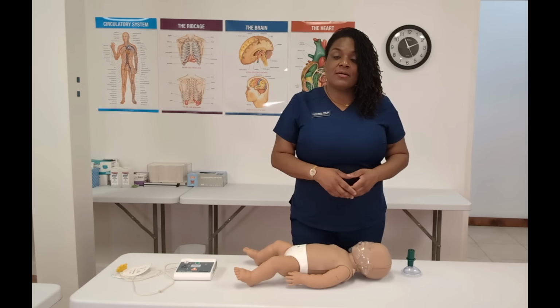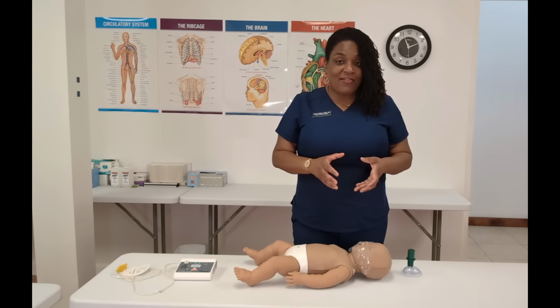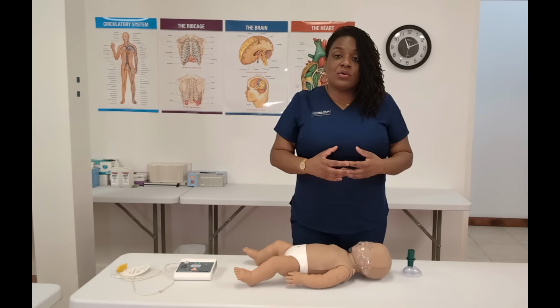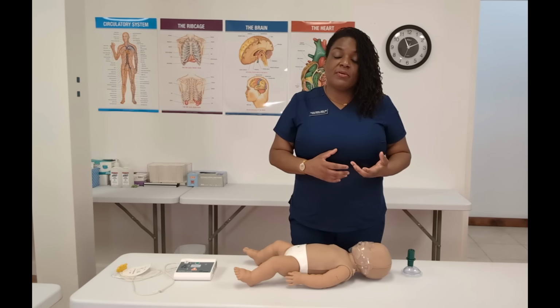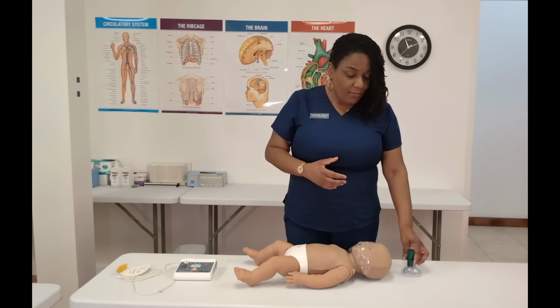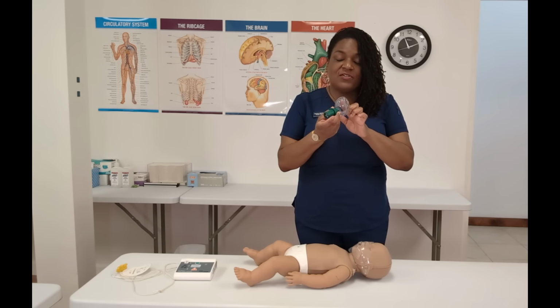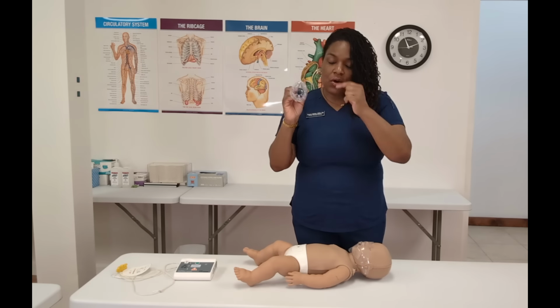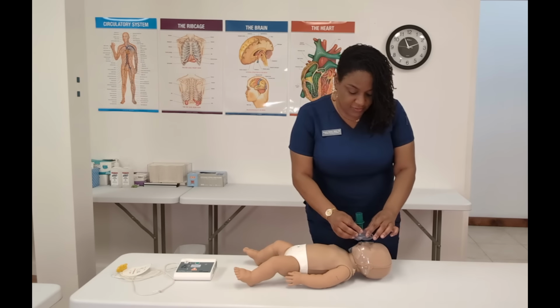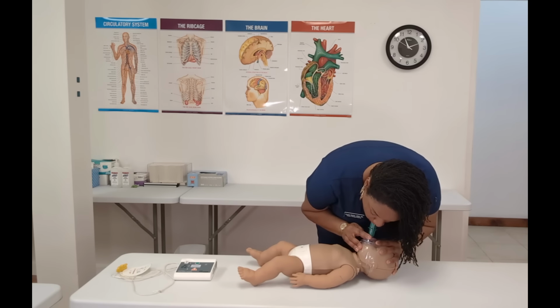For an infant, you'd be compressing 1.5 inches or still 1/3 the side view of the chest, allowing for full chest recoil, and you would still be performing at least 100 up to 120 compressions per minute. If you have your pocket mask with the one-way valve, if you remember from the previous video, the angled portion goes towards the bridge of the baby's nose. We're going to do our head tilt chin lift, and we're going to give a breath.